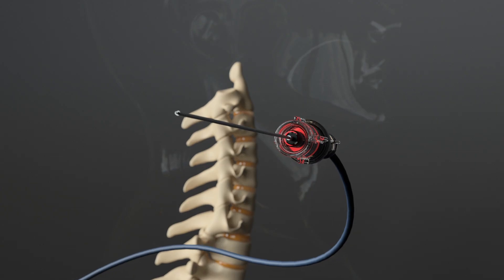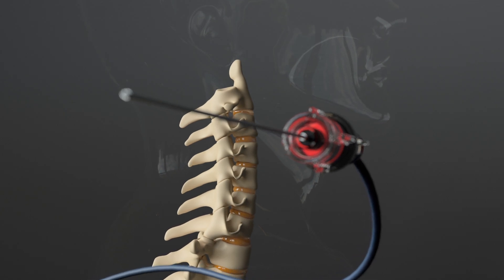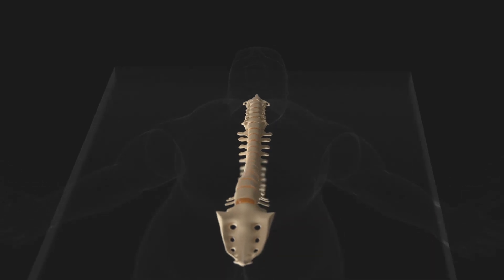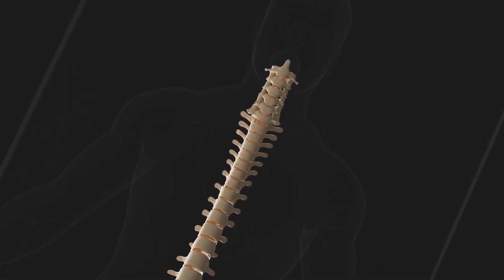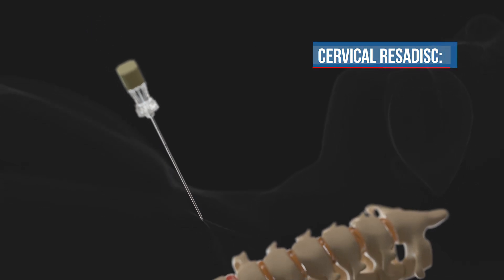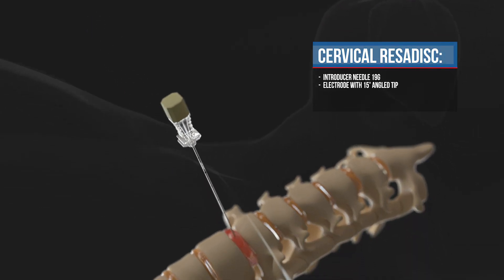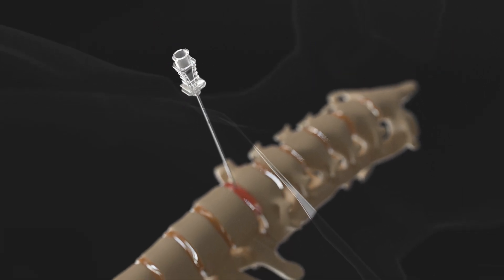The cervical decompression technique is performed with minimally invasive access, anterolaterally. Lay the patient in the supine position and undergo normal sedation procedures. Carefully spread the sternocleidomastoid muscle and the trachea so that the introducer can be positioned within the disc nucleus.